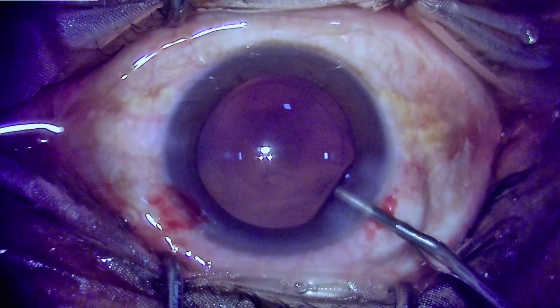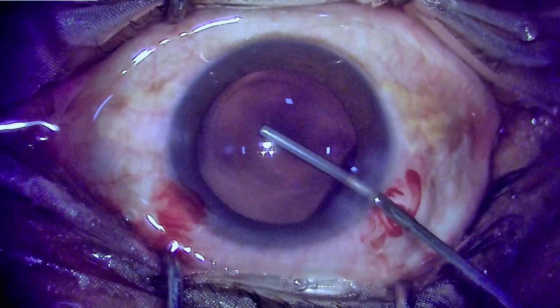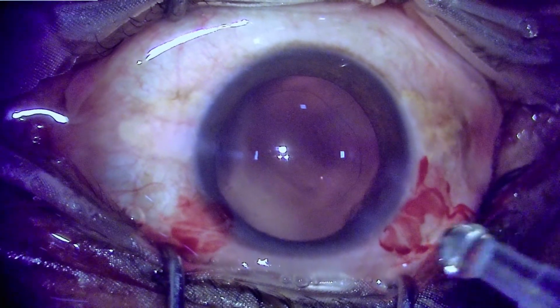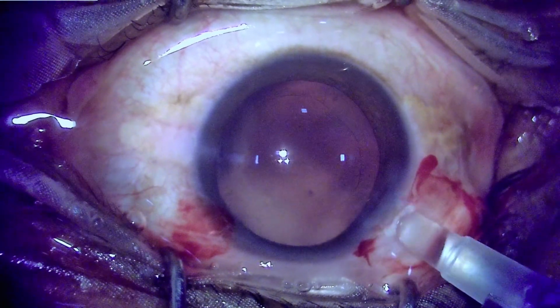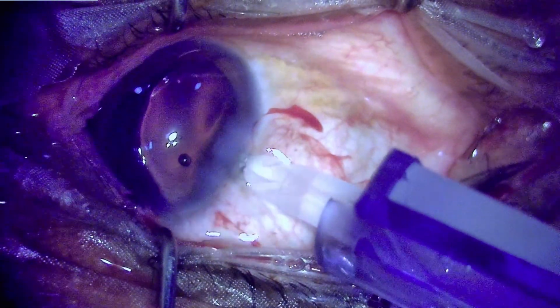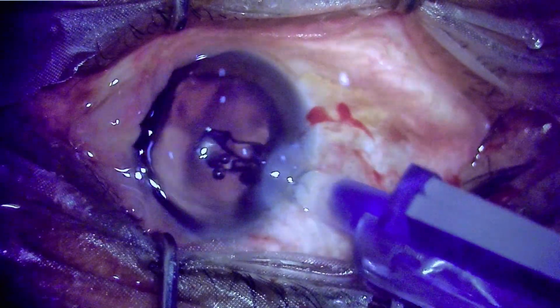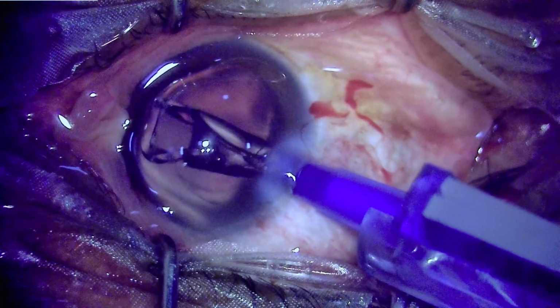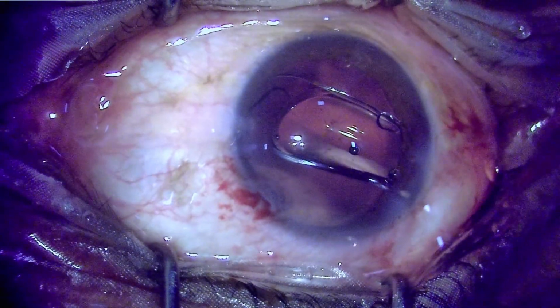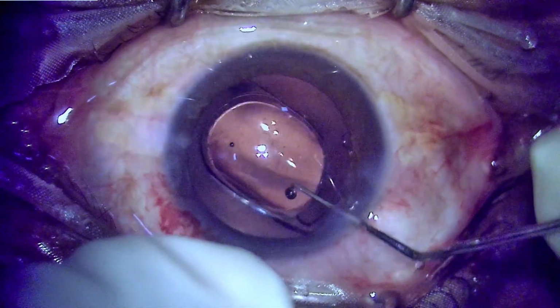Injecting the viscoelastic and also using it to polish the posterior capsule so as to remove remaining sticking tidbits of the lens fibers. So this is a preloaded IOL from Aurolab, which is a negative aspheric lens, and it also provides some amount of extended depth of focus, which is very useful if the patient is opting for a monofocal lens, and I've seen patients getting good vision, even up to 6x6 unaided and N6, because of the negative asphericity.